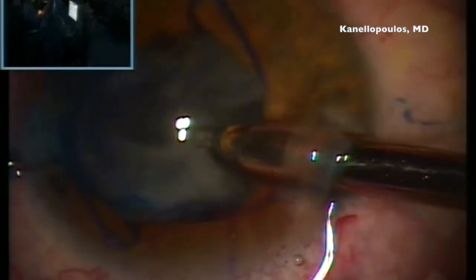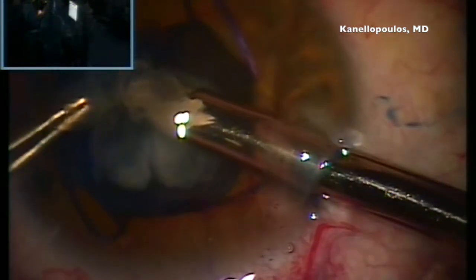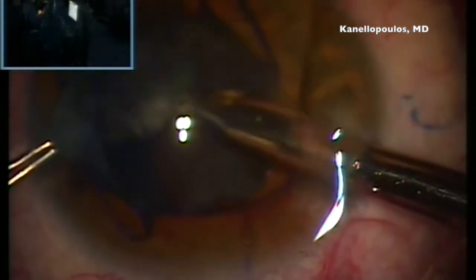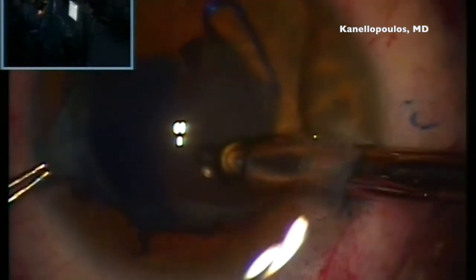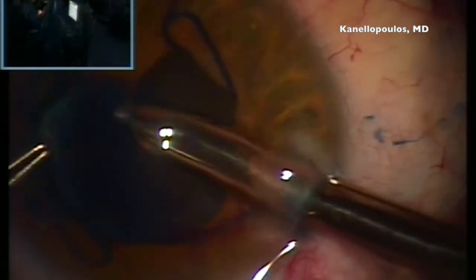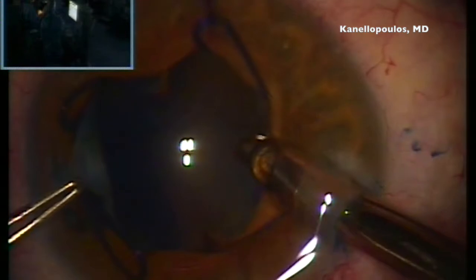I'm holding the anterior capsular flap created with my hand to avoid having it engage with my irrigation aspiration tip. I'm bringing the forceps with the flap in to help emulsify the parts of the lens absorbed, and we're finally starting to see some red reflex, some light at the end of the tunnel, and the gratification that our procedure is advancing very nicely.